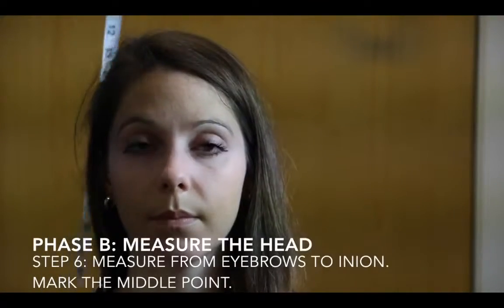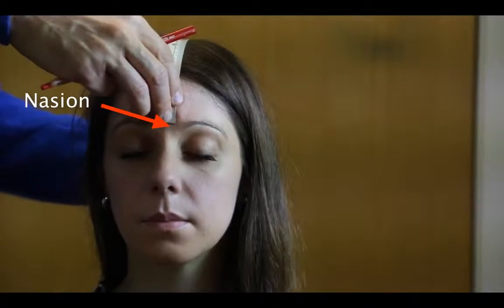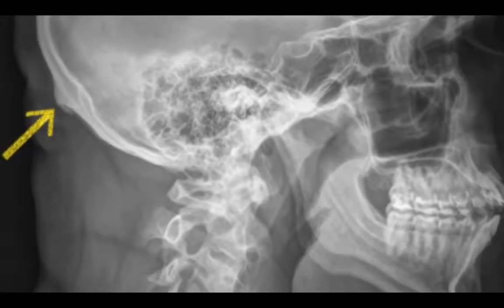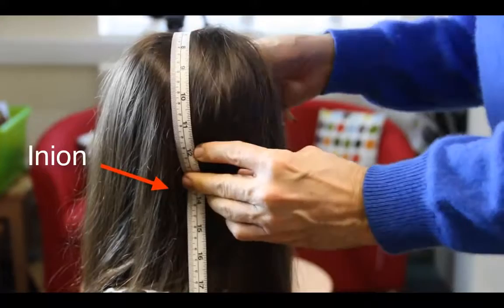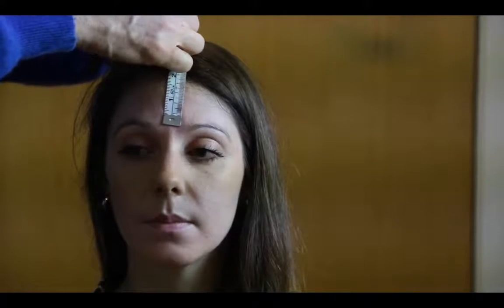Next, you're going to measure from the nasion, which is the point right in between the participant's eyebrows, to the inion. The inion is the bony part or projection of the skull that sticks out. You can feel it with your fingers. Once you've found those 2 points, hold the measurement tape. Divide by 2 to find the center, and make another mark.